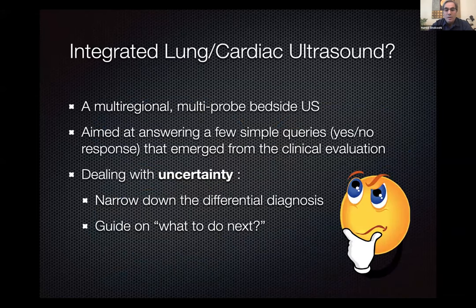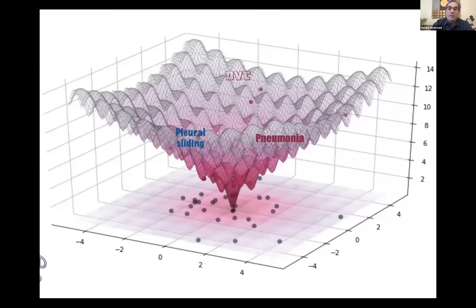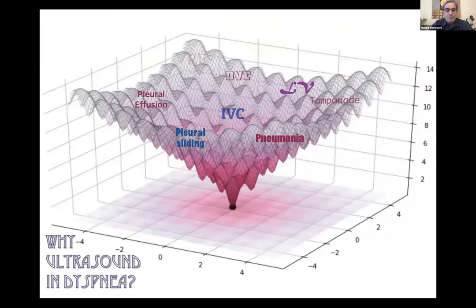So all you need to remember is that ultrasound or CT or X-ray per se cannot answer your questions. This is the integrated lung and cardiac ultrasound. You cannot just look at the lung and decide whether this patient can be treated the way COVID patients are treated differently. So it's very important to keep the cardiac examination as well.